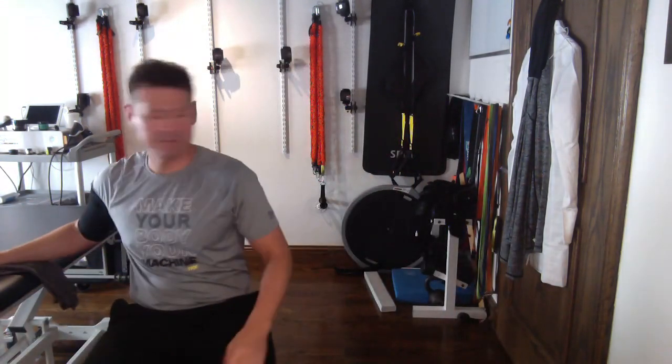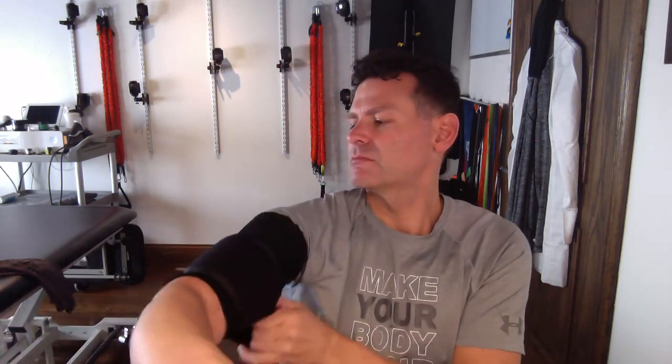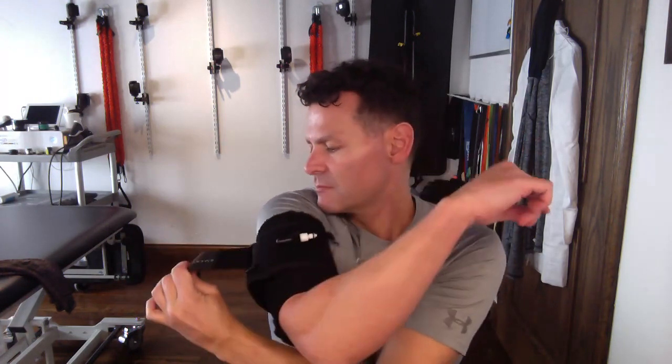So now what I need is my cuff. I'm going to take my cuff and — if you notice — I put it through the D-ring and then flap it under. I want this stem to face forward so that it's a lot easier for me to attach my pump. I'm going as high up as I can, right below the deltoid, so I'm up as high as I can on the arm. Now you can see I've got the stem facing forward, and it's going to be a lot easier for me to attach my pump.